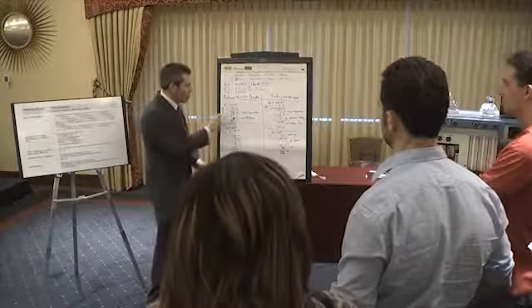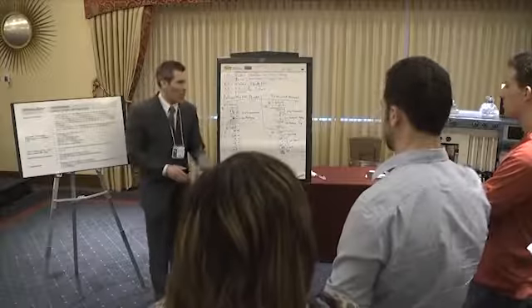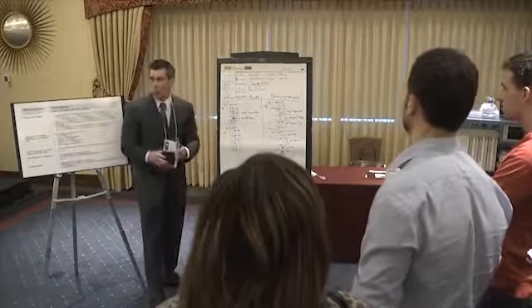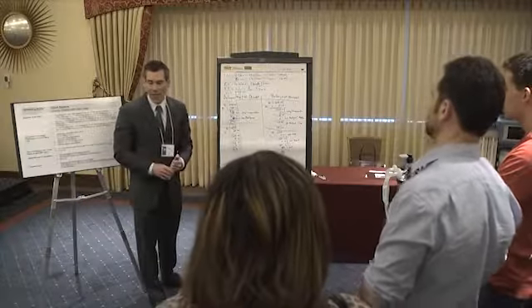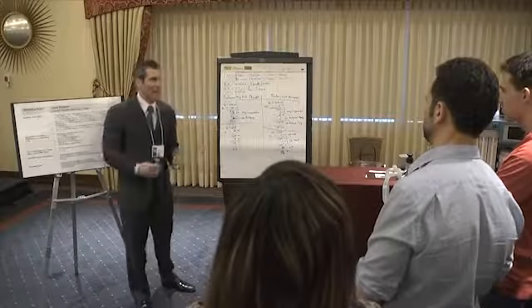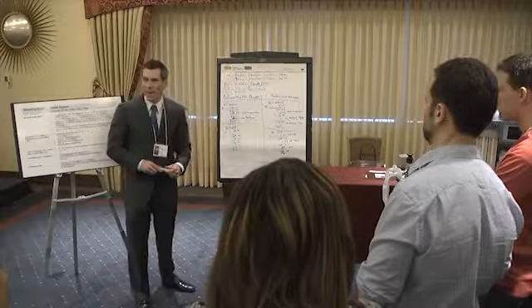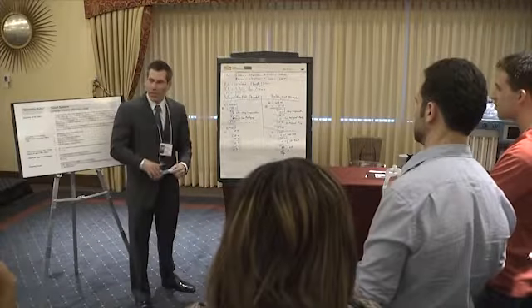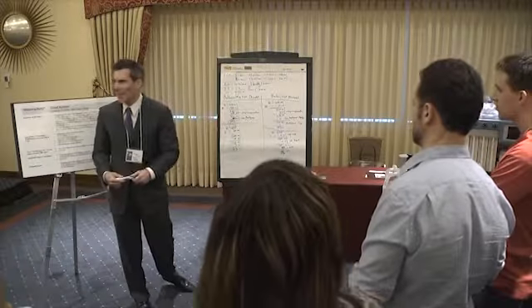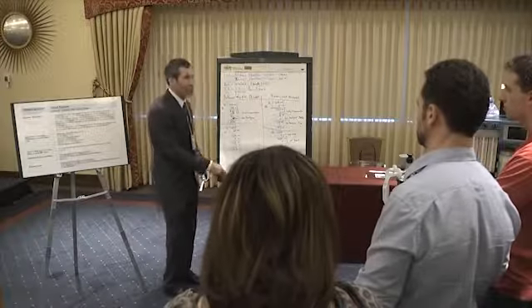And I think the most important thing to take out of here is all the variables that go into your tidal volume. It's not just what I set is what I get on the older machines. It's more on the newer machines. You have more control of what you do. I think the most significant thing is that when you have a patient decompensating, the human body is one of the most dynamic things on earth, and when they get sick, a lot of things start happening within the body. When you start adjusting the anesthesia machine, it starts doing things that you did not intend it to do, and it's important to keep track of those and to account for those when you're making your decisions clinically.